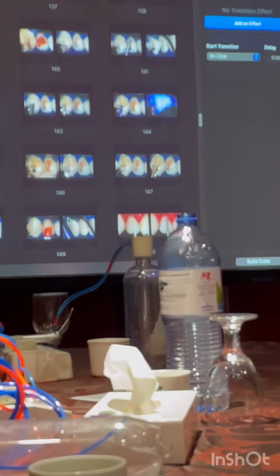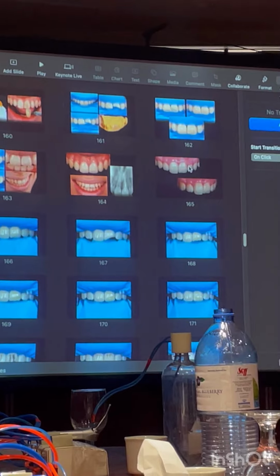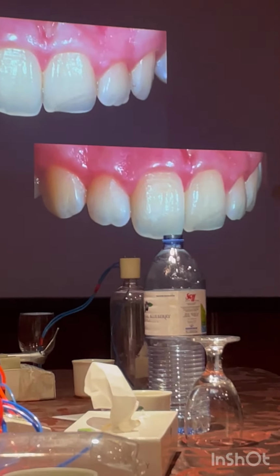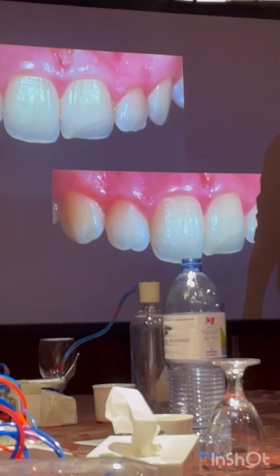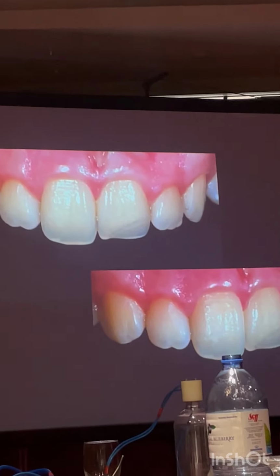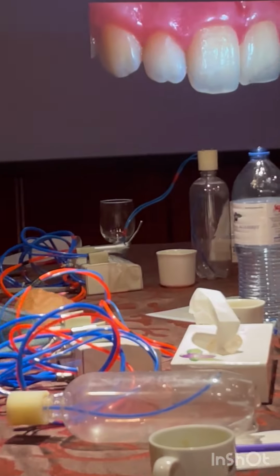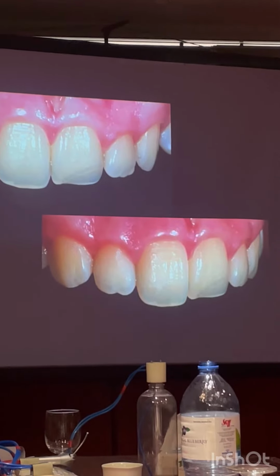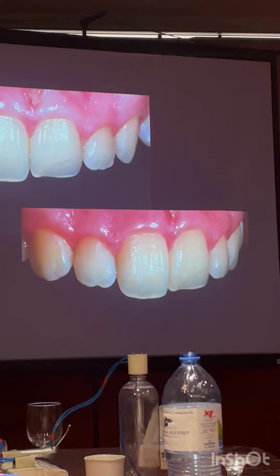A high texture case. Let's look at this. For example, this patient comes with a very poor restoration. Can you see? This dentist has used only enamel, because he was not aware. This is the problem. He has the composite enamel, but he doesn't know it is enamel. He thinks it's body. That's why please see your inventory. So now this patient says it looks very, very translucent, very grey.